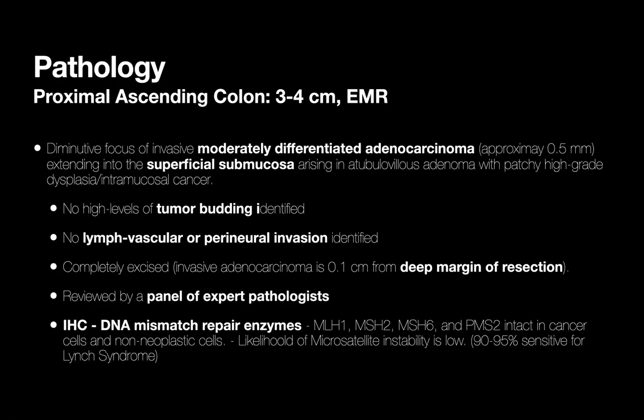Getting back to the macroscopic assessment, I was worried actually about the proximal part of the lesion, which could not be well visualized in the beginning. So maybe the focus of submucosal invasion was there. I'm not sure. But anyway, this underscores the importance of taking decision based on macroscopic assessment, because if it was a lateral spreading tumor of granular type, we could remove it by piecemeal resection in many pieces. But that could be actually unfavorable in this case.